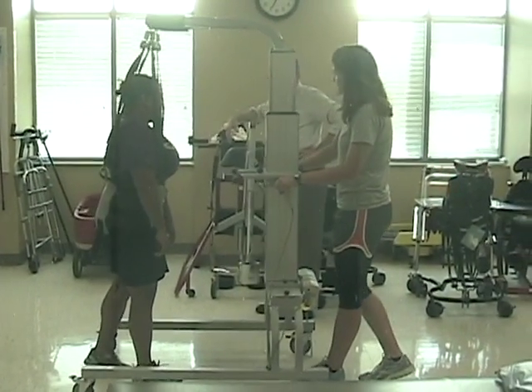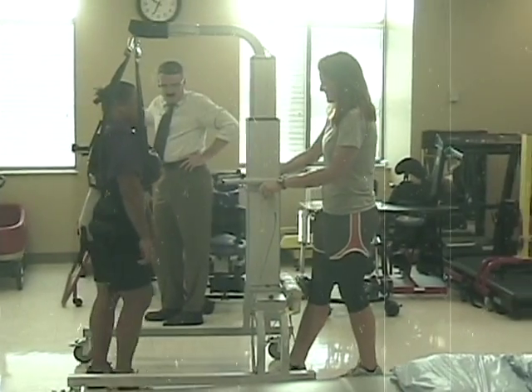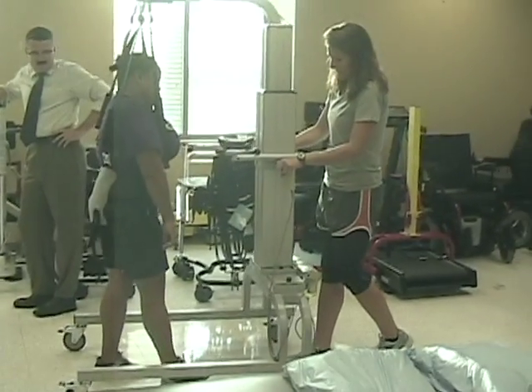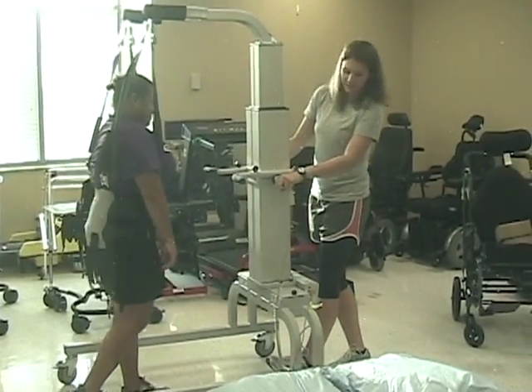The light gate can also be placed over a treadmill. Because of its hands-free qualities in this position, the therapist can assist in lower extremity advancement and neuromuscular reeducation.